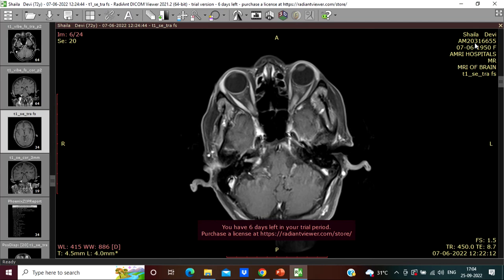There are 2 vestibular nerves, superior and inferior. The inferior one is close to the cochlear nerve. So this tumor is most likely arising from the inferior vestibular nerve. Already affected hearing means it has already adhesions with the cochlear nerve or compressing on the cochlear nerve. So let's see how it turns out to be.